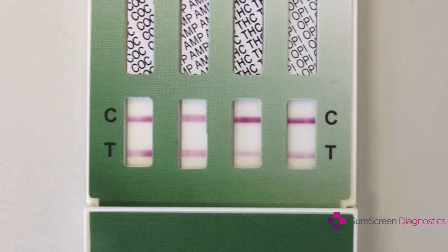You can already see on the test the urine sample has carried the red dye with it and it's reacted with the antibodies. You can already see a red line where the test line is, showing that no drug is present, and a red line on the control line showing the test has worked properly and has wicked up and carried out the reaction.